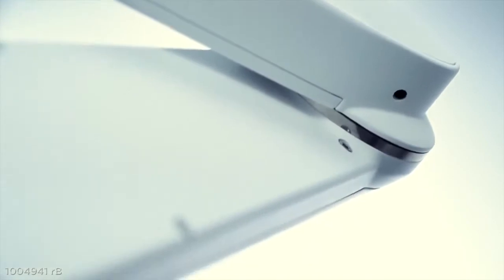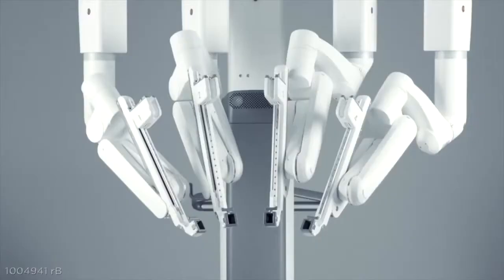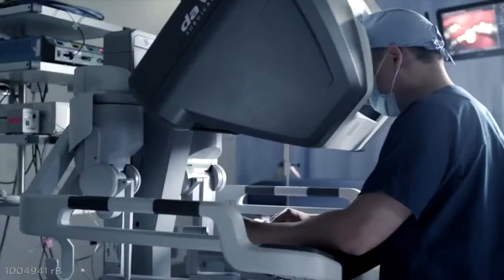The DaVinci XI is our fourth generation DaVinci system and it has in it over 20 years of learning how to enhance surgical performance by creating a natural extension of the surgeon's eyes and their hands.